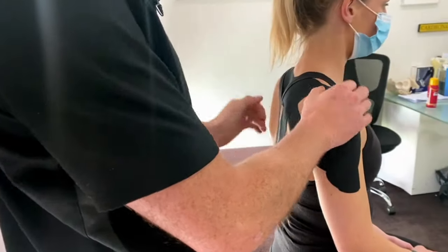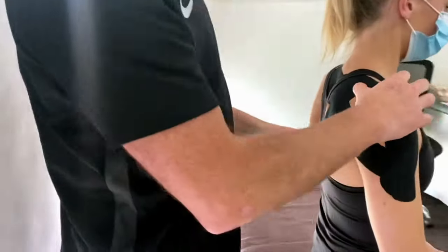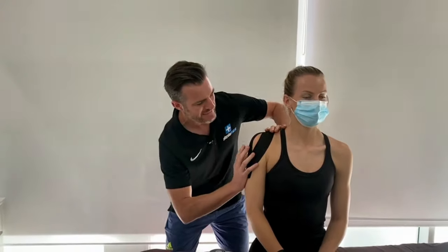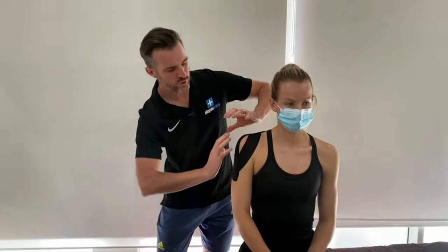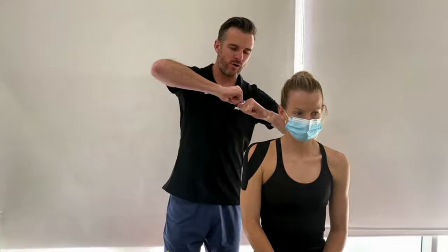If you've got all the right angles it will pull the shoulder back slightly. I don't need much scapular retraction taping here — some people don't like being pulled back all the time because it actually stretches the AC joint at the front. So if they've damaged that joint they often prefer a mid or slightly forward position. You work on scapular and serratus and lower trap exercises to get them flat; you don't have to pull them back. This taping is more about suspending the humerus and acromion upward to offload the AC joint.